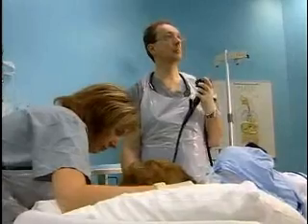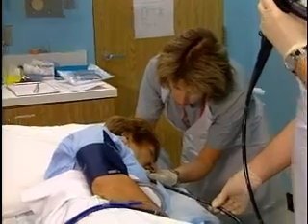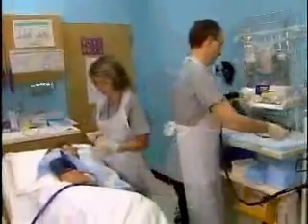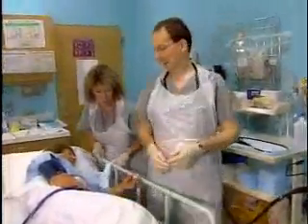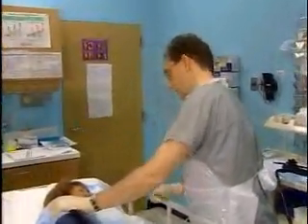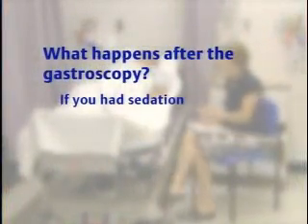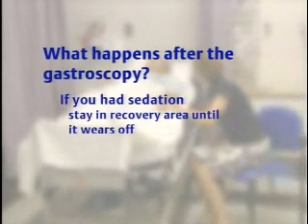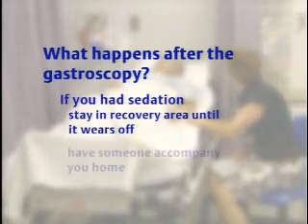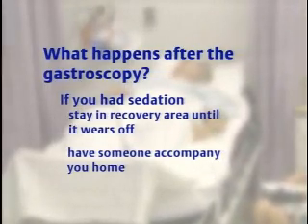What happens after the gastroscopy will vary from one clinic to another. Once the procedure has finished, the patient's vital signs — blood pressure, oxygen concentration, and heart rate — will be checked by the nurse before they leave the endoscopy suite. If the patient has had sedation, they will usually remain in a recovery area for observation to make sure the sedation wears off properly, and there should be somebody to accompany them home or drive them if necessary.